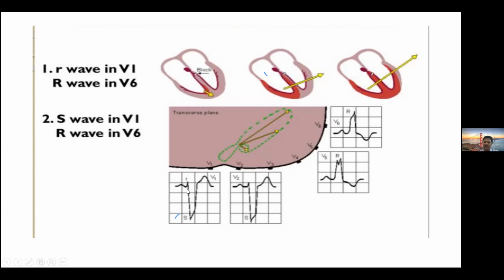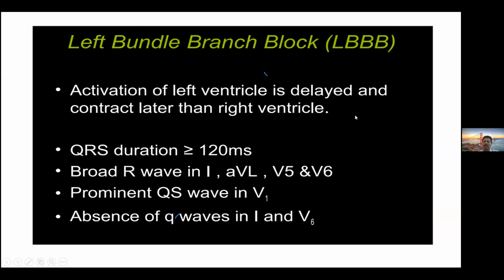So there is a loss of R wave. And the initial negativity will be there completely because the complete conduction happened from right to left. The whole ventricle is conducting. So there is a loss of septal Q wave. V5, V6 will not show septal Q wave. And there will be a tall, positive, wide QRS complex in V5, V6.